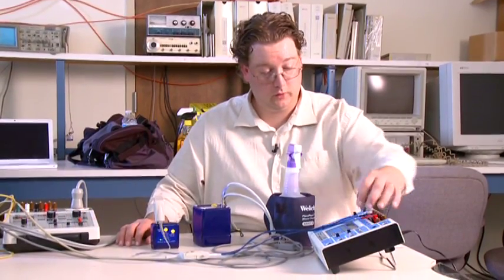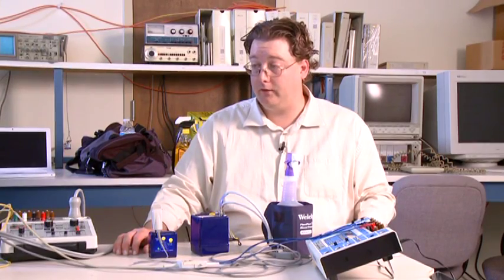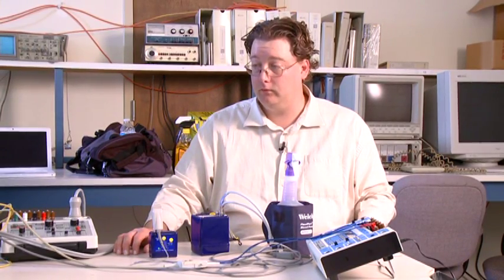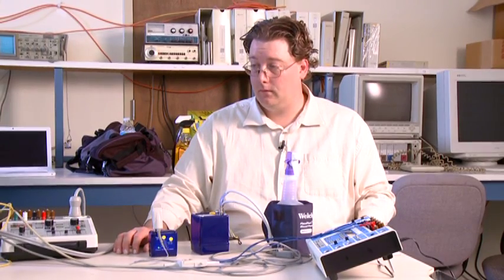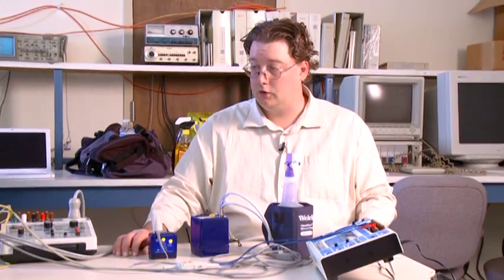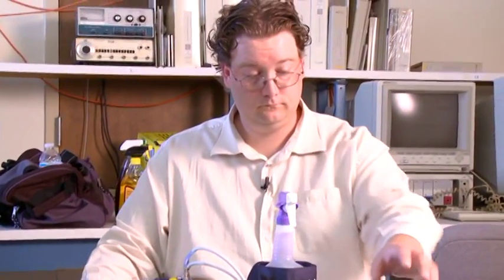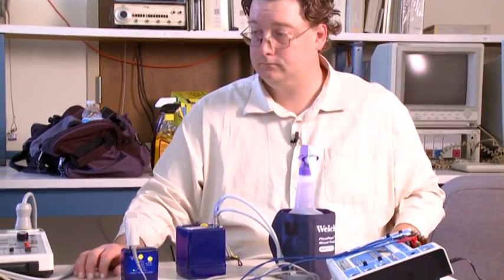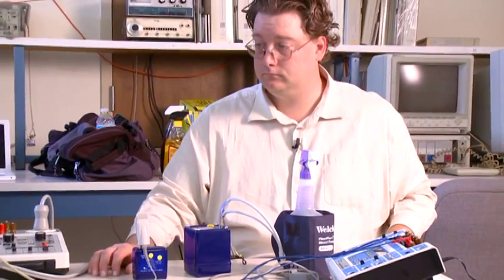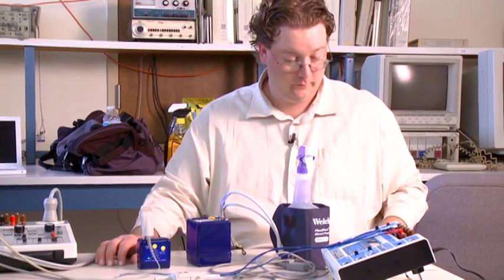Then we're going to bump our tester up to 60 breaths per minute. And again, let this have a minute to record the correct value. Joby, if you could record 60. Then we're going to increase the rate to 120 breaths per minute. And we've got 120. Joby, if you could record that number, please.